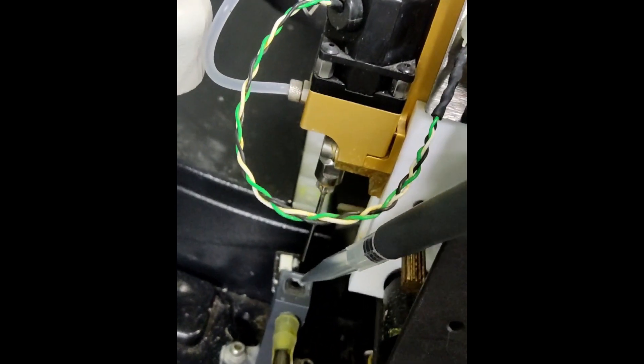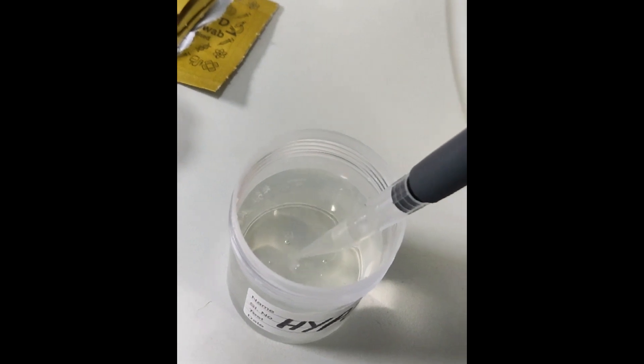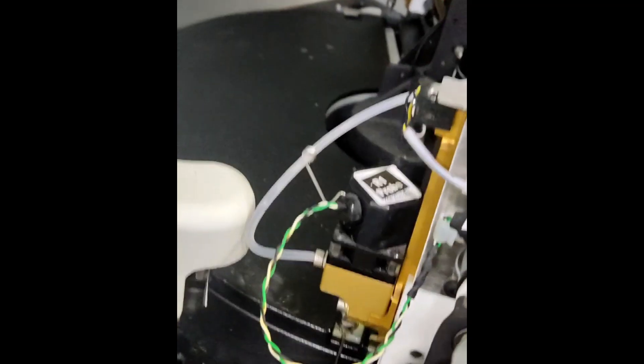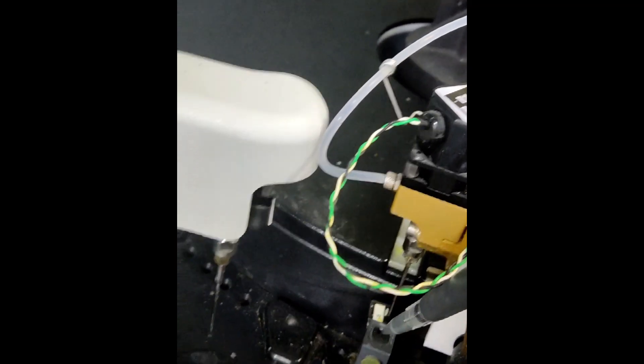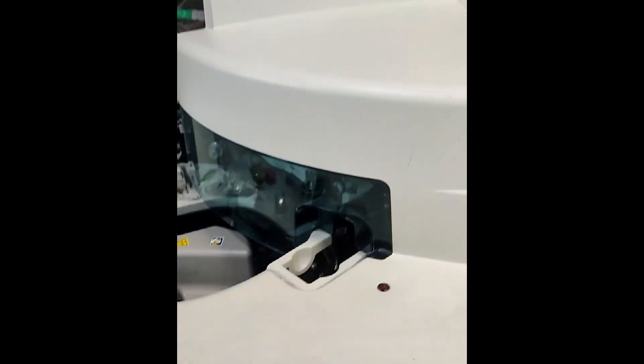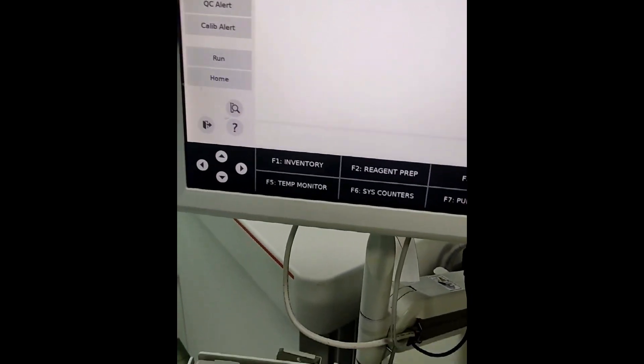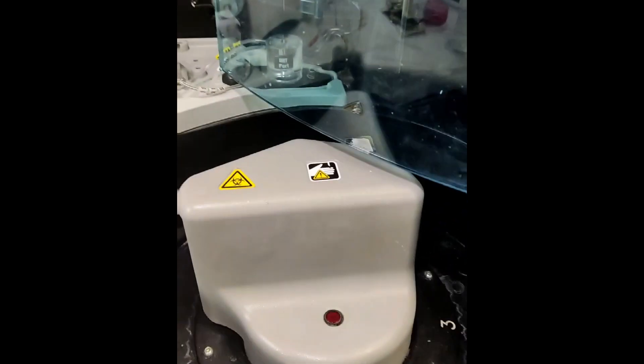In the same way, we do it for the Reagent R1 probe as well. We will then close the cover and reset to initialize all the systems. All the probes will return to their original positions.